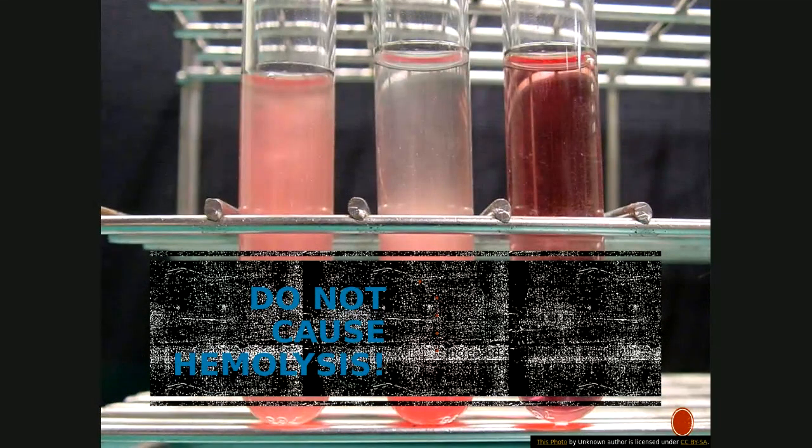This can be caused by excessive milking or squeezing of the fingers. This can also be caused by not allowing the alcohol to dry. This can also be caused by excessive mixing or agitation of specimen tubes. So instead of doing a gentle inversion, you shake it. This can be found on page 390 in your clinical alerts.